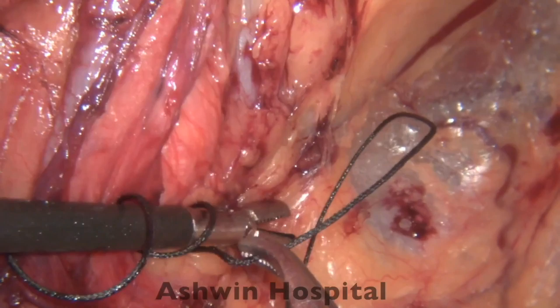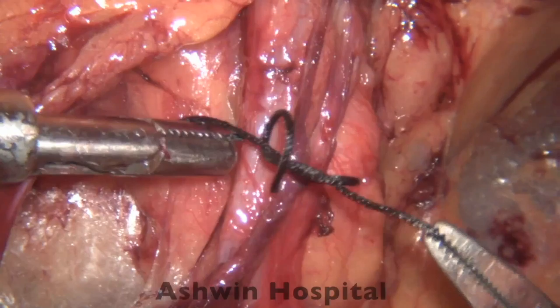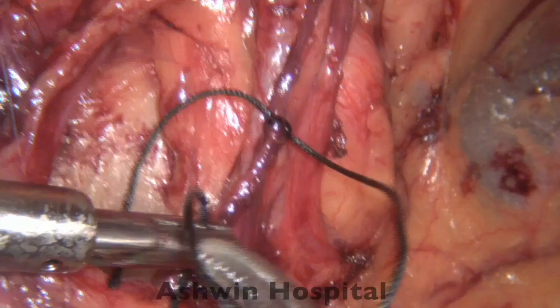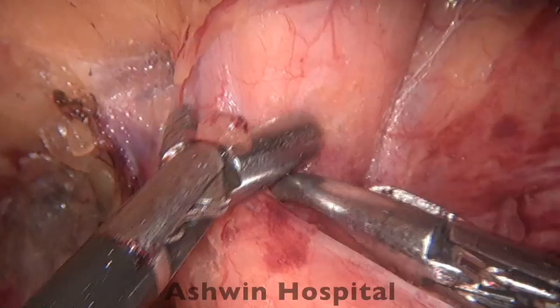So this port position is one of the main advantages, is you can have a good triangulation and do a laparoscopic knotting and suturing similar to how we would do it in any other laparoscopic surgery, because you have a good triangulation. Or the other option would be to just hold the sac with your left hand, a big atraumatic instrument, incise the sac distally and then apply an endoloop immediately. That also would work, because this is only done at the end of the dissection and you've already created the plane well.